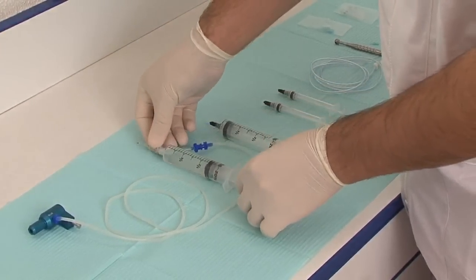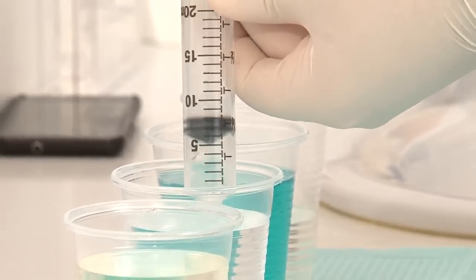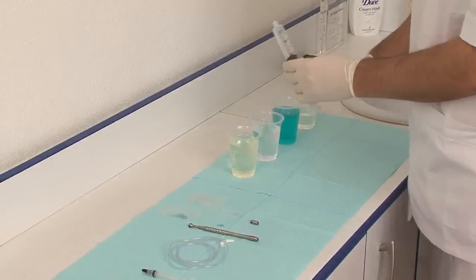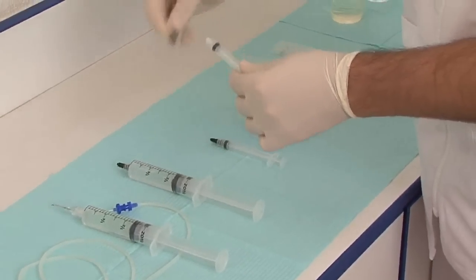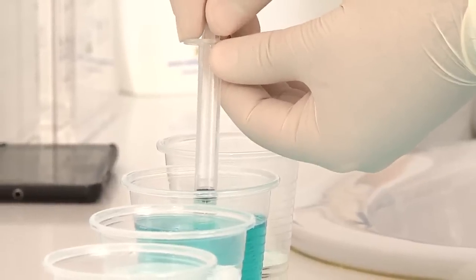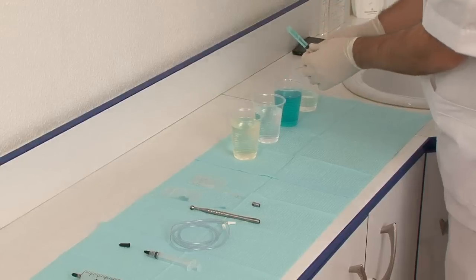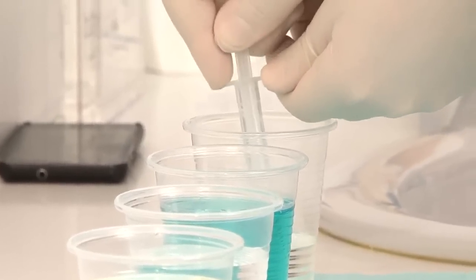The other main syringes can be loaded with sodium hypochlorite if you like, or with distilled water depending on your irrigation protocol. The smaller syringes can be loaded with chlorhexidine, and the other one can be loaded with an organic acid like EDTA, 17%.